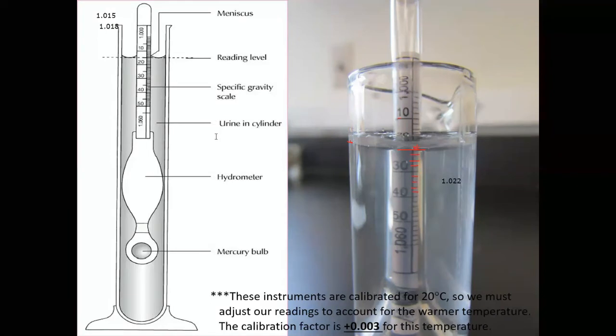Okay, so your job will be to look through the next images. Okay, so B through F samples, and you are going to measure, analyze the specific gravity, type in the raw reading, and then add 3 to the last digit in the thousandths place right here.